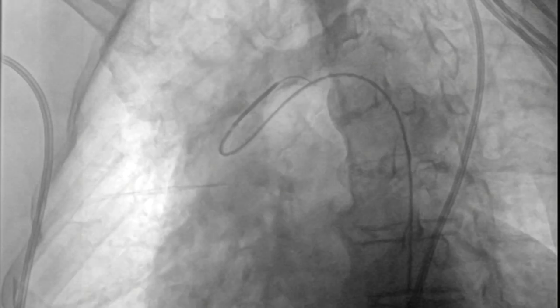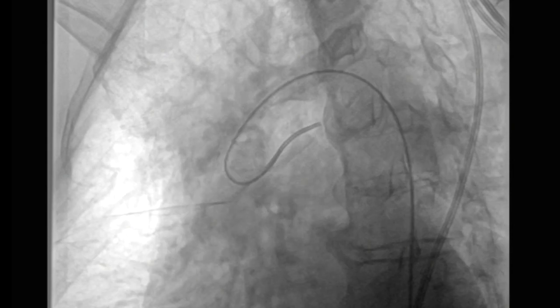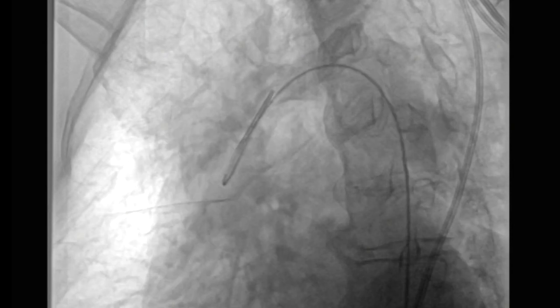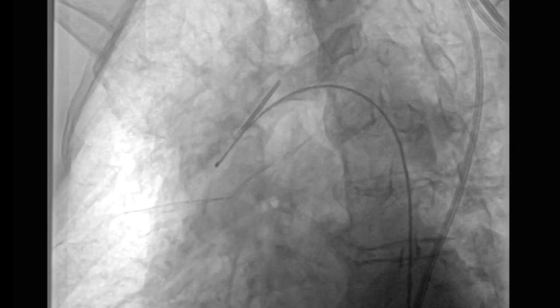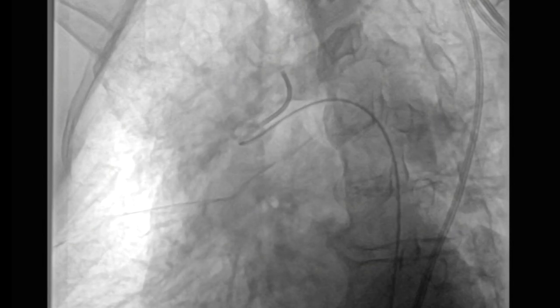Unlike other catheters where you push forward to engage the orifice, these are reverse-curved catheters and you pull them back to engage the origin of the carotid orifice. What you look for is that characteristic pop as the catheter engages there.